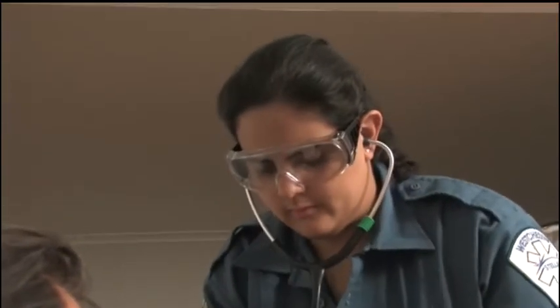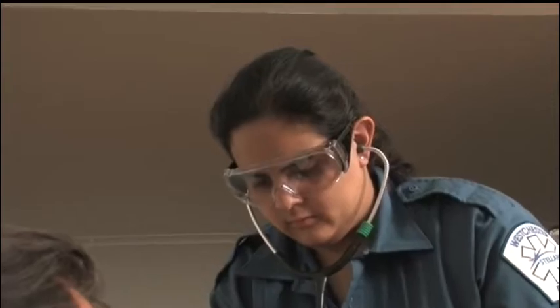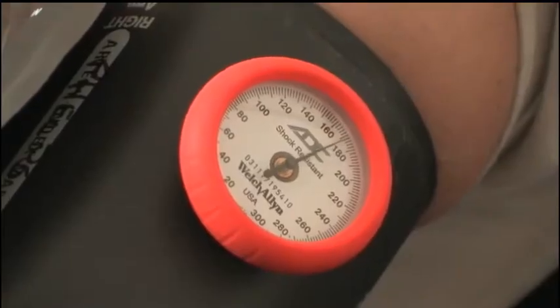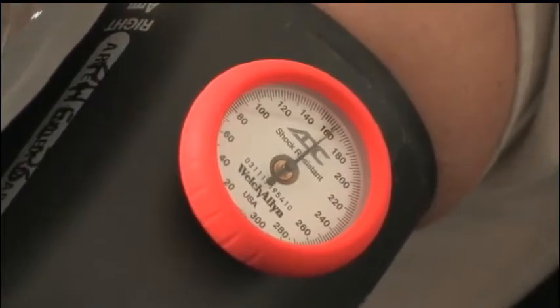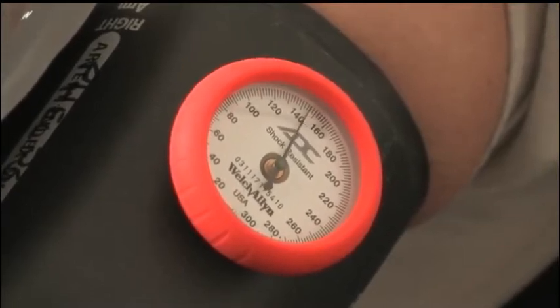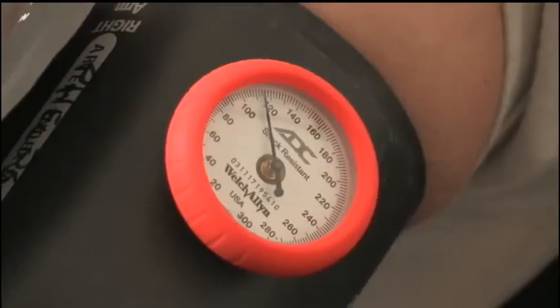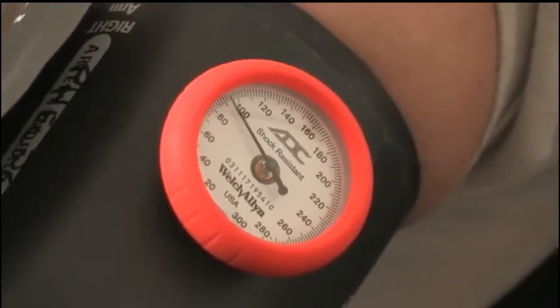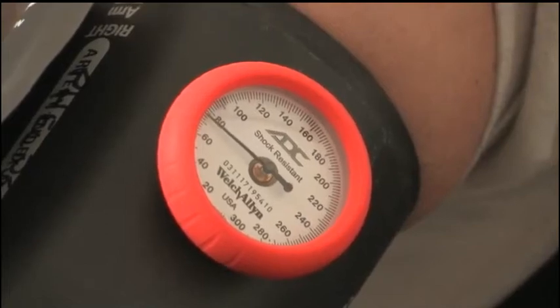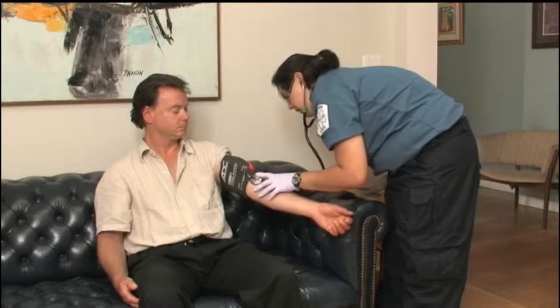Using the stethoscope, listen for the sound of the pulse returning as the pressure in the cuff is slowly released. Note the number on the cuff's gauge as soon as you hear the first pulse beat — this is the systolic pressure, the top number of the BP fraction. Continue to deflate the cuff, this time listening for the point at which the beats fade. Note the number indicated on the gauge — this is the diastolic blood pressure, the BP fraction's bottom number.